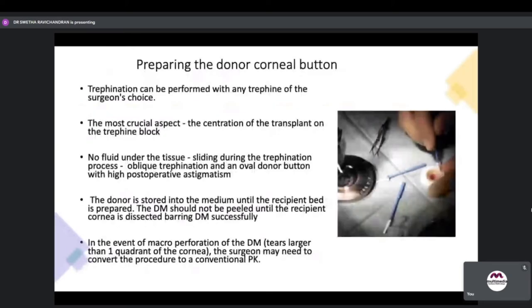Preparing the donor corneal button: trefination can be performed with any trefine of the surgeon's choice. The most crucial aspect is centration of the transplant on the trefine block with no fluid under the tissue to prevent slipping — slippage causes oblique trefination and an oval donor button, which affects post-operative astigmatism. The donor is stored in medium until the recipient bed is prepared. The Descemet's should not be peeled until the recipient cornea is successfully dissected baring the DM. In the event of a macro-perforation of the DM where the tear is larger than one quadrant, conversion to conventional PK may be necessary.